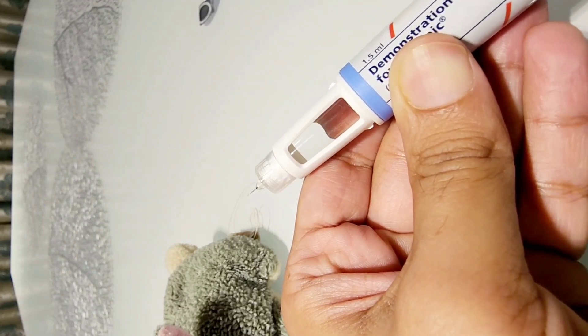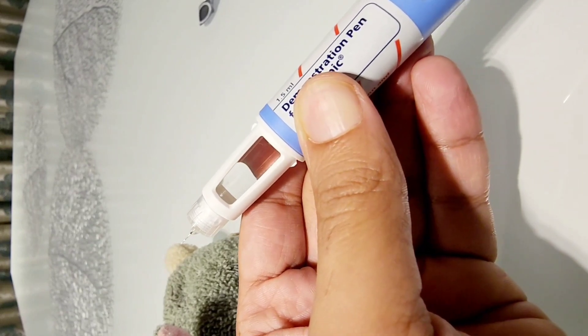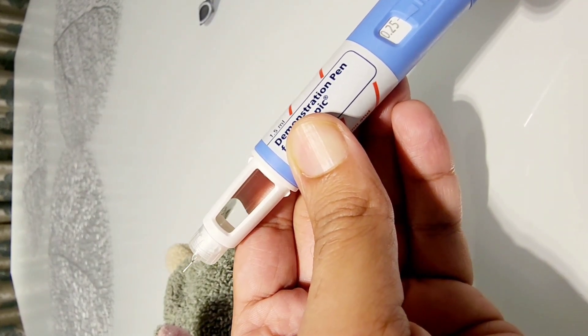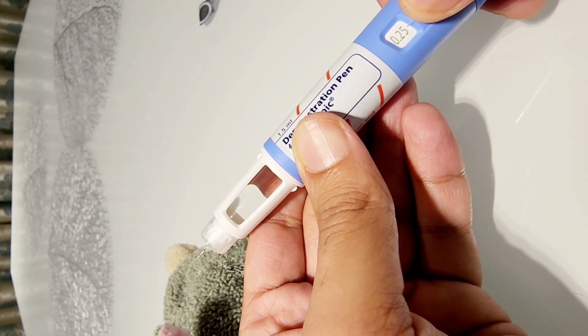If there is a drop coming up which suggests that the pen is working fine, then you dial all the way to the end. So when you dial all the way to the end, for example this is a demonstration pen for 0.25 milligrams.